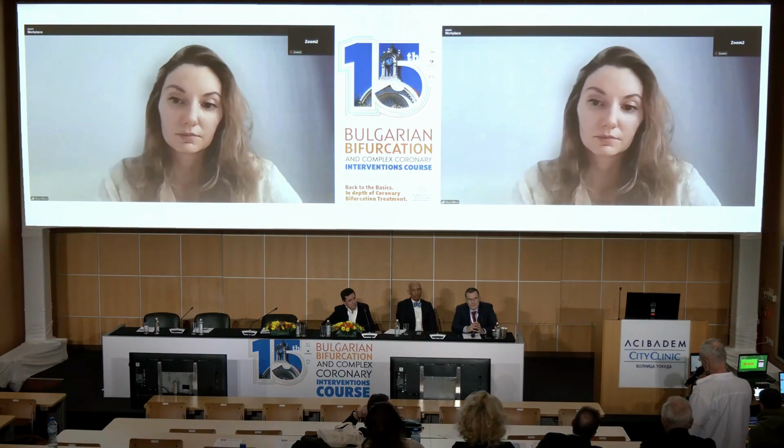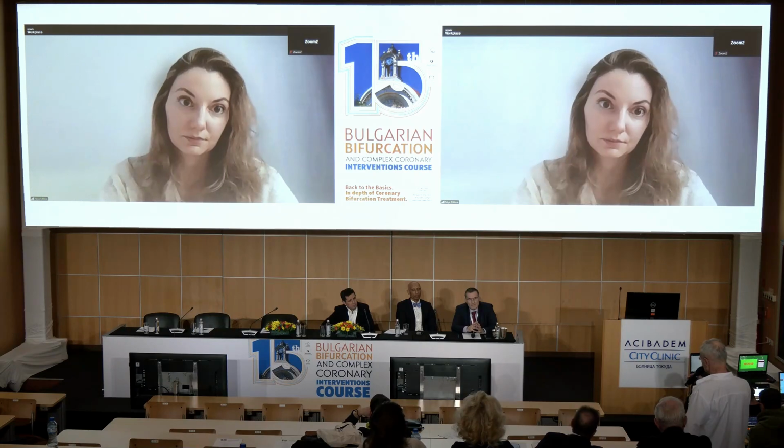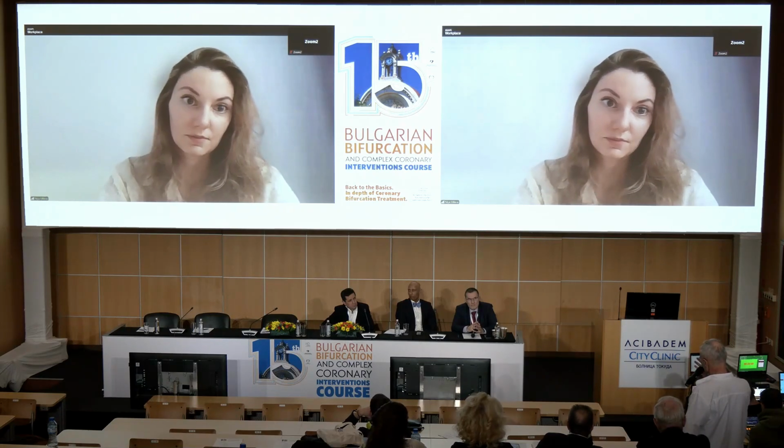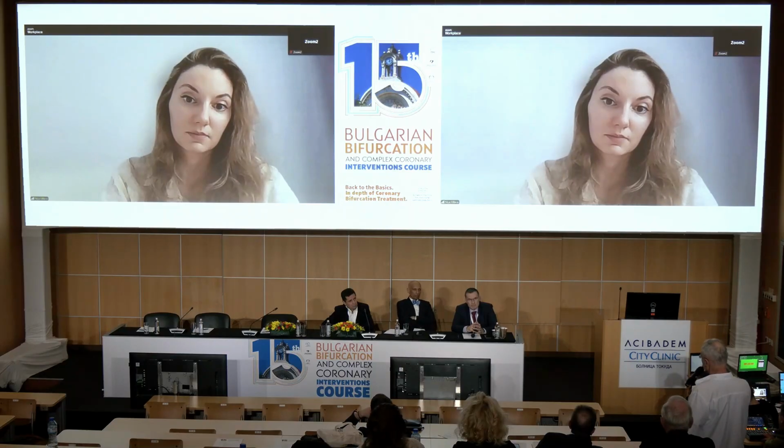So personally, I believe in it more. I was not so much in favor in the past, but I believe that if you get the information of the CT, especially with the new protocols that allow lower radiation, it can help on the planning. But if you do 100 procedures with or without CT, I'm not talking about failures, the success rate might be the same. But the economy of the procedure is going to be much more efficient with CT-based planning.